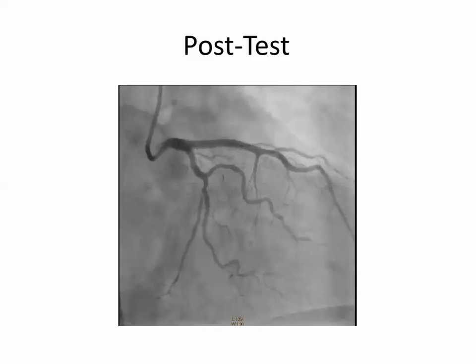This is the main bypass view, and this is good for cannulation. If it's difficult here and you go to the wrong pathway, you can go to the LAO caudal. This is RAO cranial because there is the diaphragm.